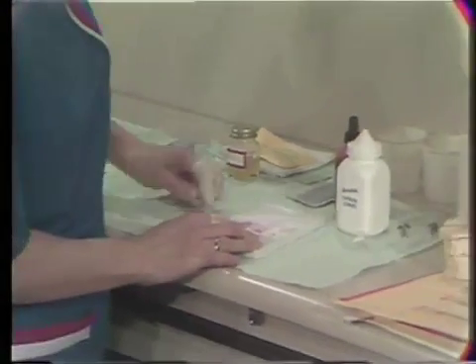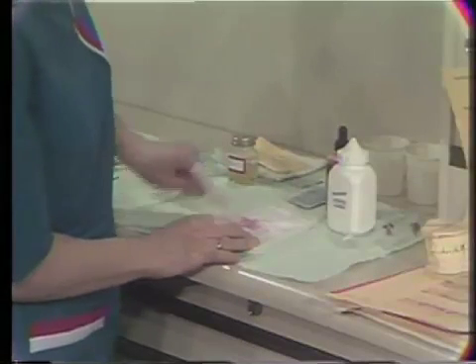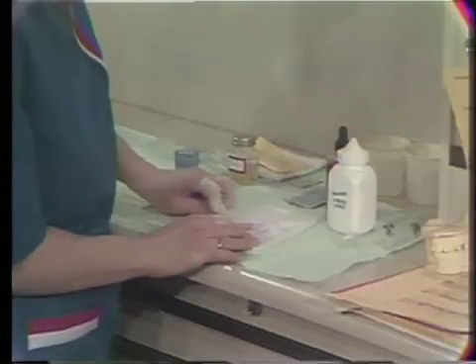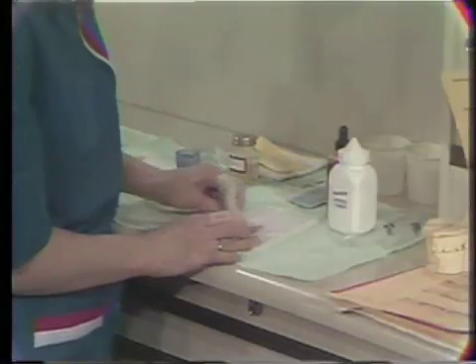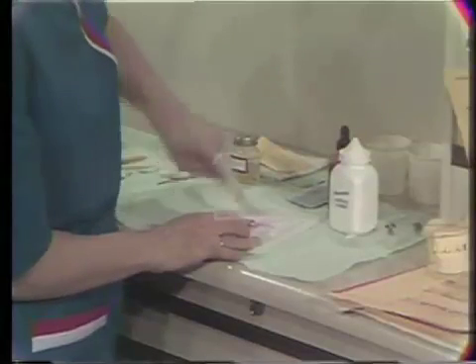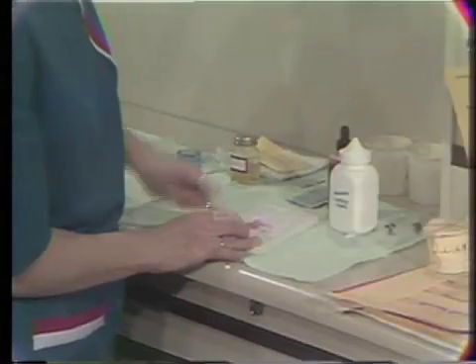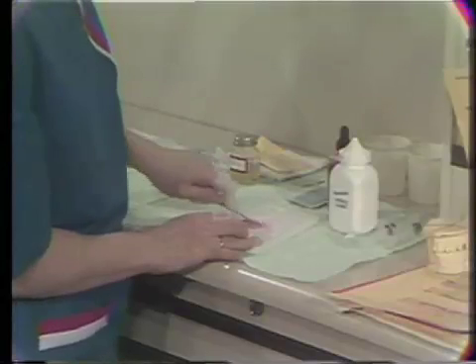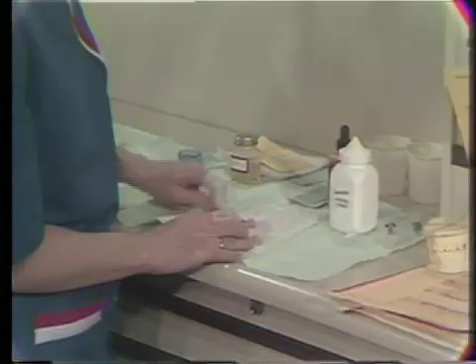Now normally during periodontal surgery, this is a time when 2 assistants will be used, at the level of 6-handed dentistry instead of 4-handed dentistry. And about the time the suturing is started, the other assistant will come into the operatory, and she'll be told how many drops are necessary to mix. So she'll be doing this during the time of the suturing of the surgical site. So at the completion of the suturing, this dressing is immediately ready to go. This is a fast-setting material, so once it's mixed and placed in the mouth, it doesn't take very long for it to set up.